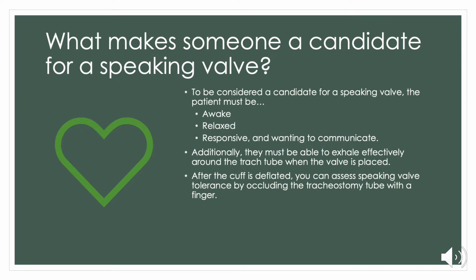It is important to note that not all patients who have an artificial airway are considered a candidate for a speaking valve. They need to be awake, relaxed, and in a good cognitive state where they are responsive and trying to communicate. Additionally, the patient has to be able to exhale around their tracheostomy tube.